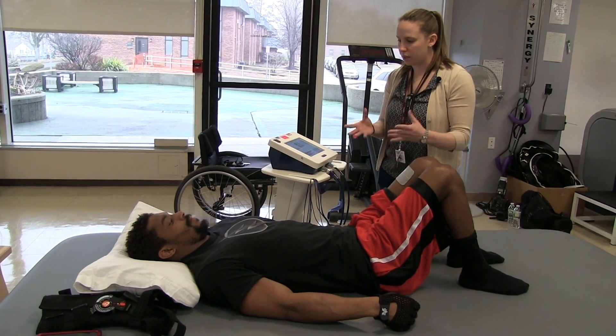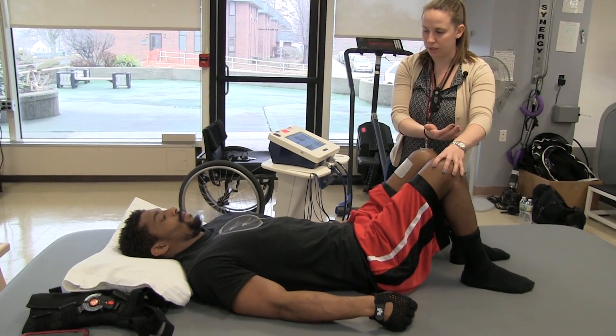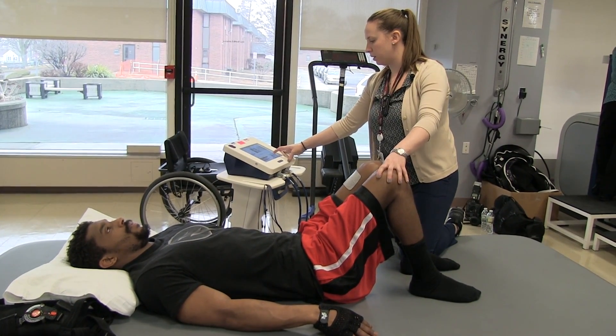So for this one, everything's going to kind of start contracting together. You're going to try to squeeze your glutes, lift them up, and just translate your knees forward, okay? We're going to do a set of ten. Ready? You got it. Go.